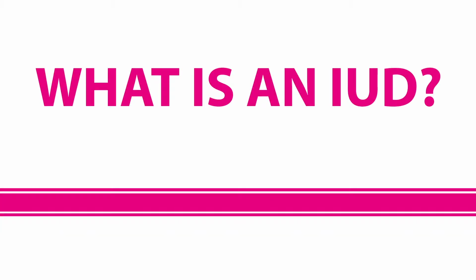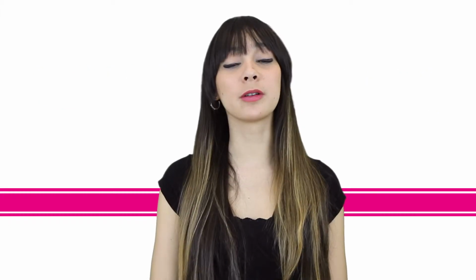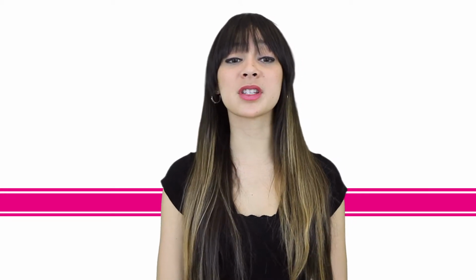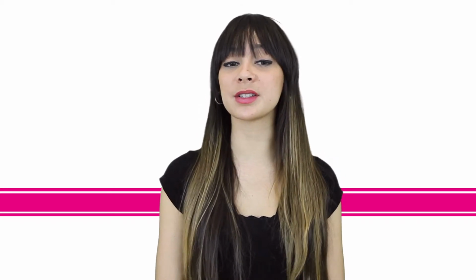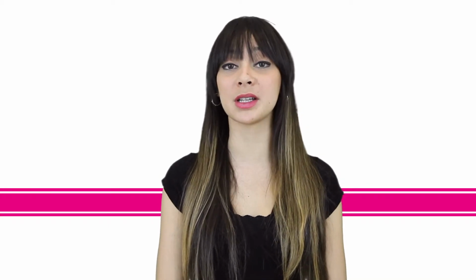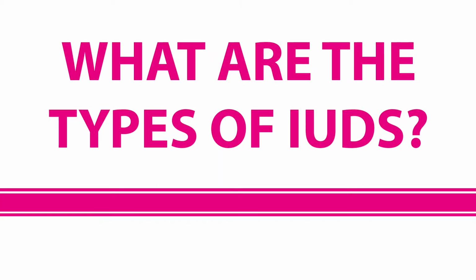What is an IUD? An IUD, short for Intrauterine Device, is a highly effective method of birth control. The IUD is a small plastic T-shaped device that is inserted by a doctor and left inside a woman's uterus to prevent pregnancy.